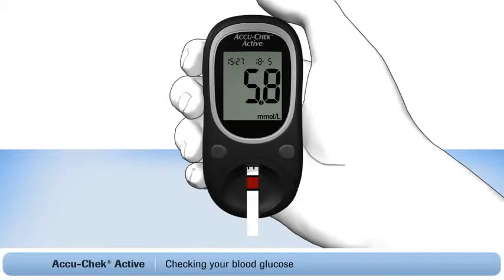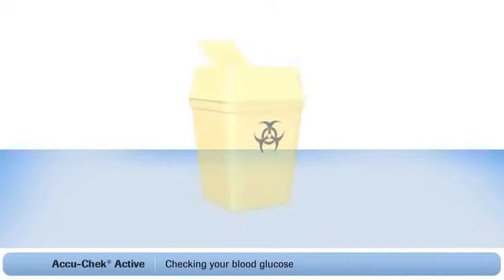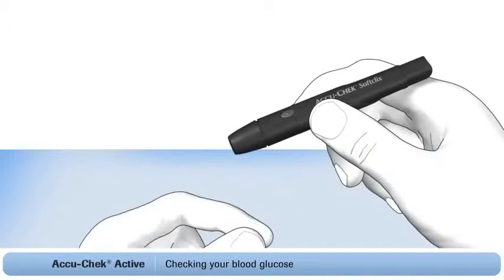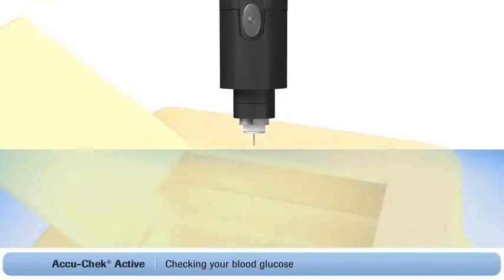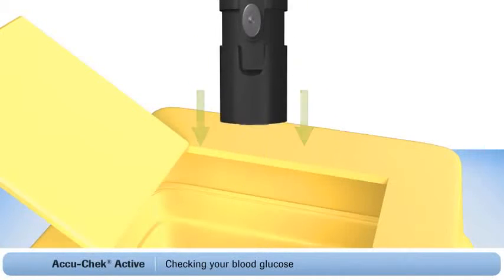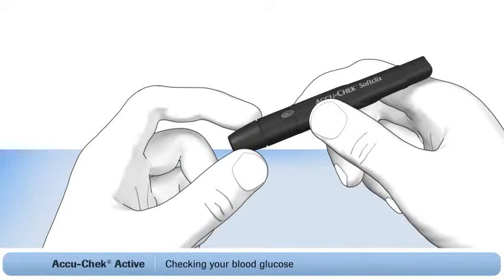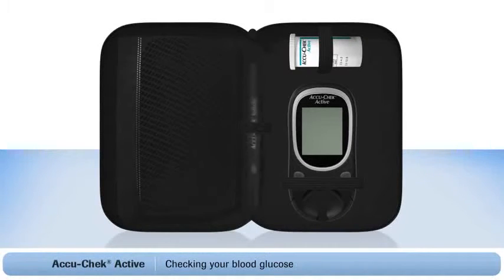2 important final steps. First, dispose of the used test strip. Then, dispose of the used lancet. Always dispose of used lancets so they cannot cause injury. Use a sharps container. Remove the cap. Then, point the lancing device into the container and eject the lancet by sliding the ejector forward as shown. Then, place the cap back on the lancing device. For best results and to minimise pain, you must always use a fresh lancet every time you check your blood glucose. Now, put everything into the carry case for the next time you need to test.